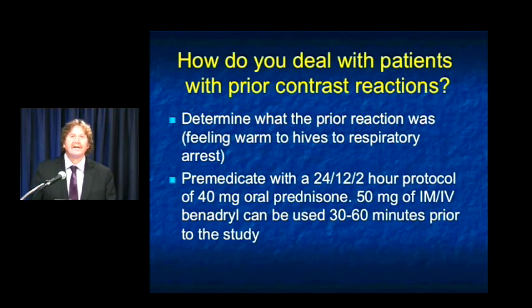A question, how do you deal with patients with prior contrast reactions? Now, one of the things I need to find out from the patient is what was their reaction. Sometimes patients say, oh, I felt really warm, or I felt funny, or I felt nauseous. That's not a contrast reaction. That's part of the contrast experience, and we tell patients not to worry. So you need to really figure out what the issue was.